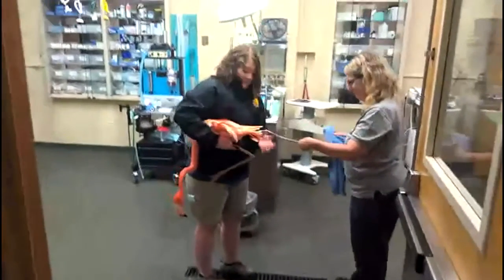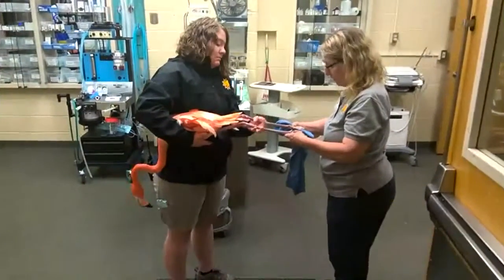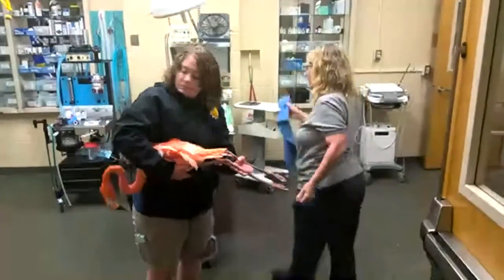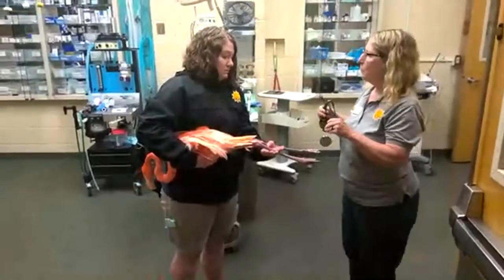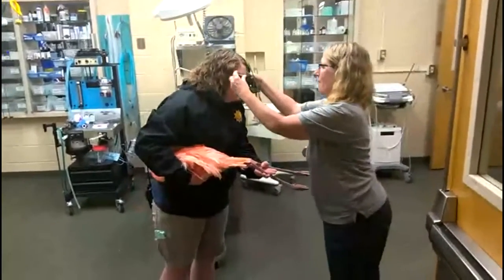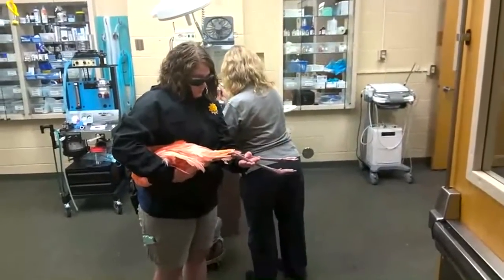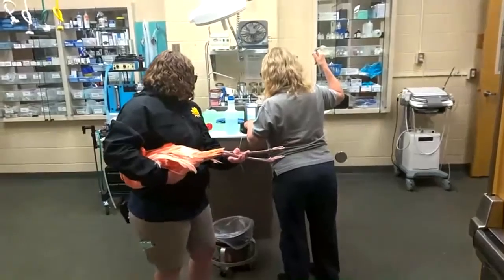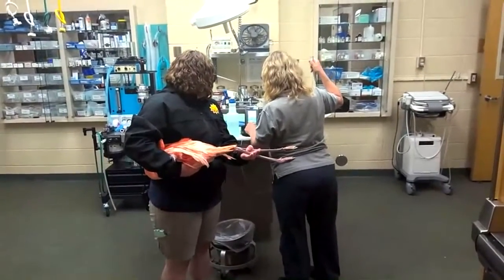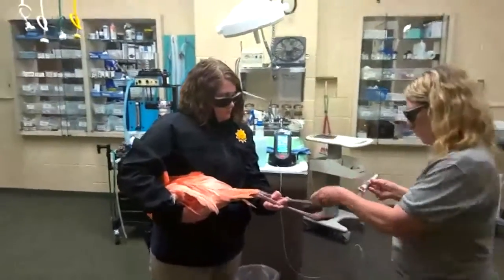So this flamingo, her name is Ampy. She has part of her beak amputated on the top. She also has some concerns with her feet. So today we are going to do laser treatment. It's a cold laser treatment, so it actually helps speed up the healing process a little bit, as well as if there's a bone or deep tissue injury, we can use that to help speed up healing. So they're going to do laser today, and then once they're done with laser, they're going to put some ointment on there that helps keep moisture in her feet. Flamingo feet, lots of water-filled feet, will crack if they get too dried out.